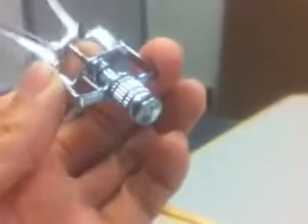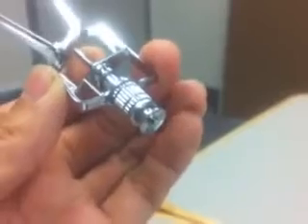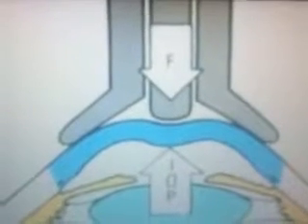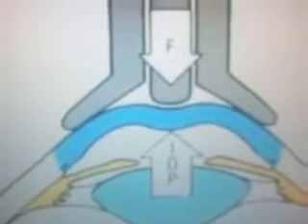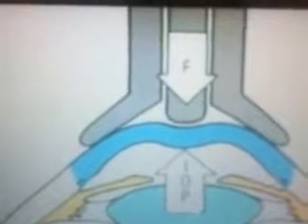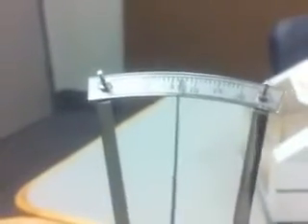If we look at the bottom portion of the tonometer, you can see the plunger, which goes in and out right here. And if we look at a schematic, that plunger would be denoted by the part of the tonometer in the schematic that has the F arrow over it. And so you can see that the intraocular pressure of the patient's eye opposes that plunger, and so that force is then translated through the plunger, up through the tonometer, which tips this scale, and then we can take a reading off of the scale.